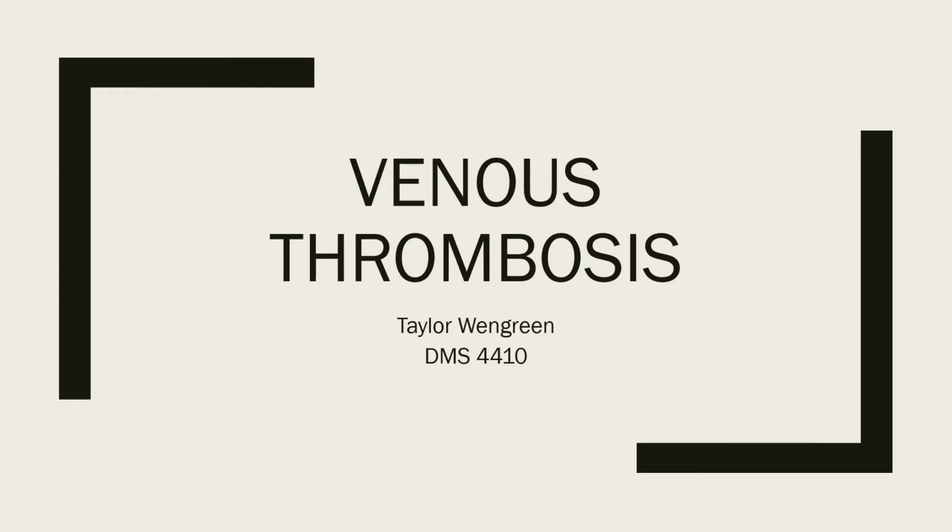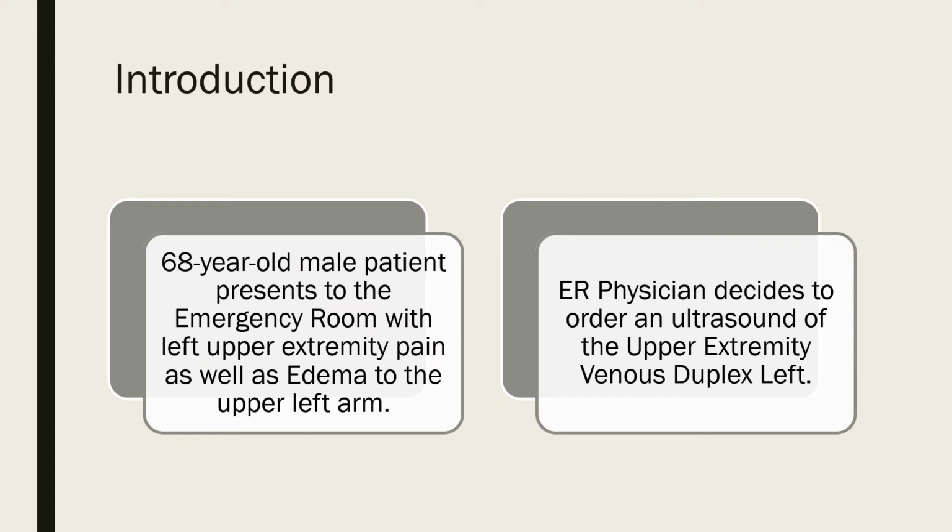Okay, so I decided to do my case study on venous thrombosis. I currently am working at my clinical site, so one of the ultrasound techs that worked there came and talked to me about it, and so it was cool because I was able to go back and see which images they got from that. So a little introduction here.